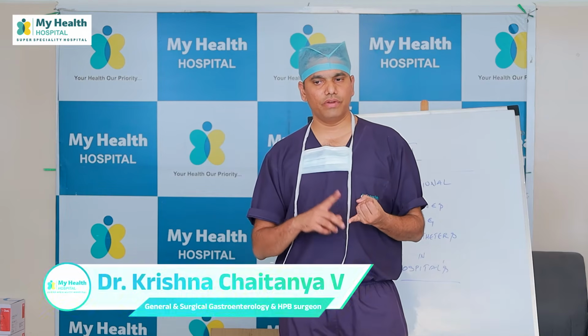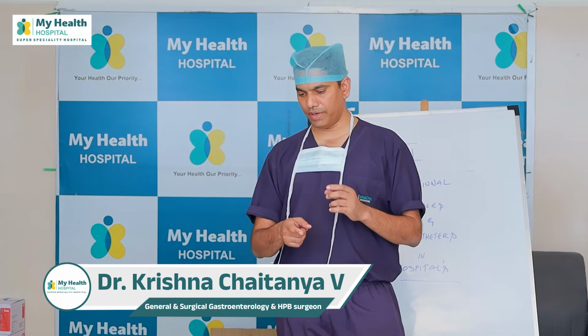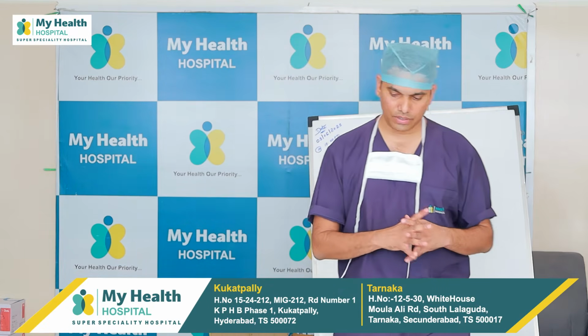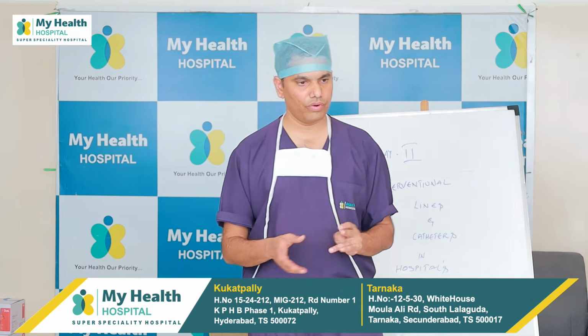It needs to be changed when there is a blockage, when the patient has thrombophlebitis, or when he has fever spikes where we don't find any other reason, or otherwise in a healthy patient. In those patients we need to change the cannula. That 3 days doesn't hold true all the time.